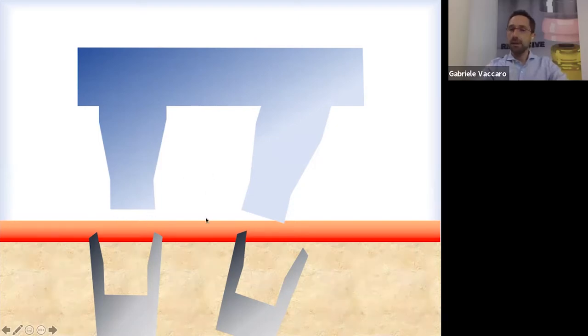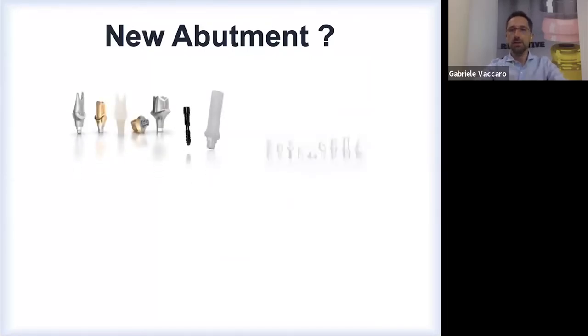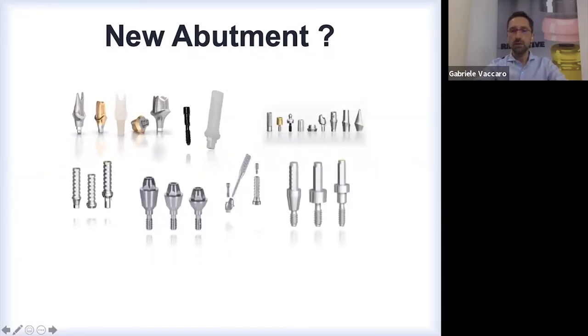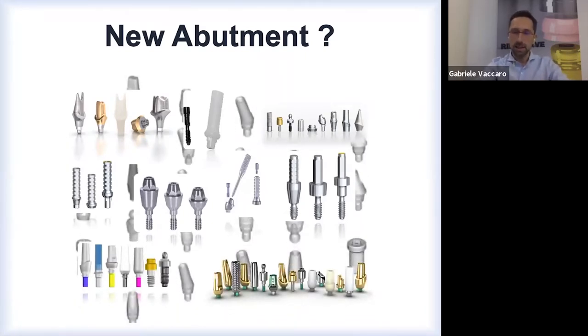It doesn't happen if I use a non-engaging transfer, because a non-engaging transfer doesn't fit into the implant, but just gives the position of the implant, the axis and the height of the implant, but not the position of the hexagon. And I don't need that. So why introduce a new abutment into the market? The market is full of new abutments for every kind of solution. Once we put in an implant, we have plenty of abutments. Maybe too many implants, too many abutments, sorry.